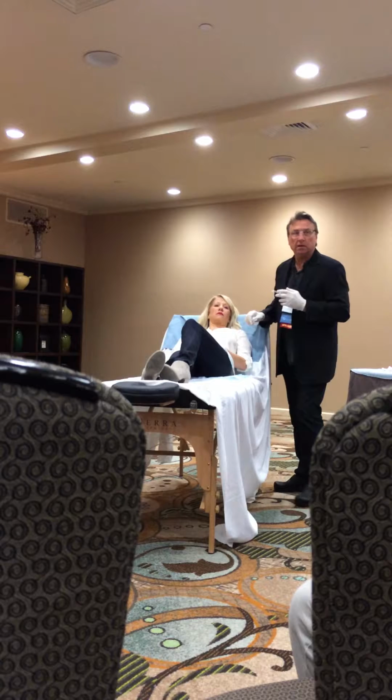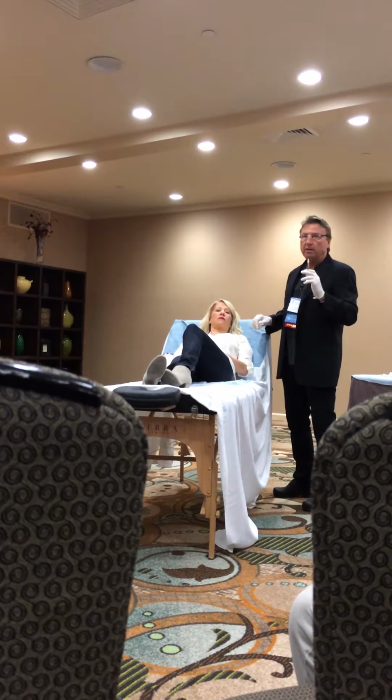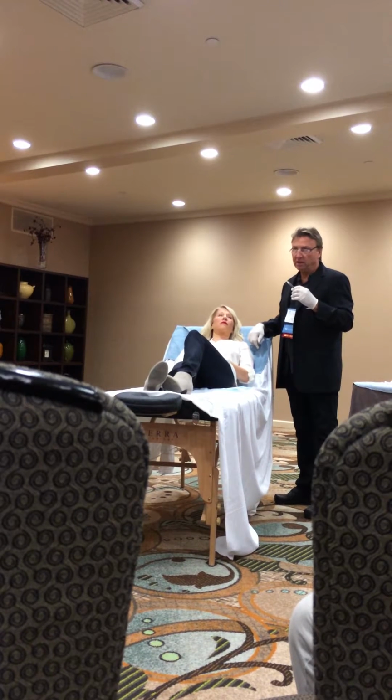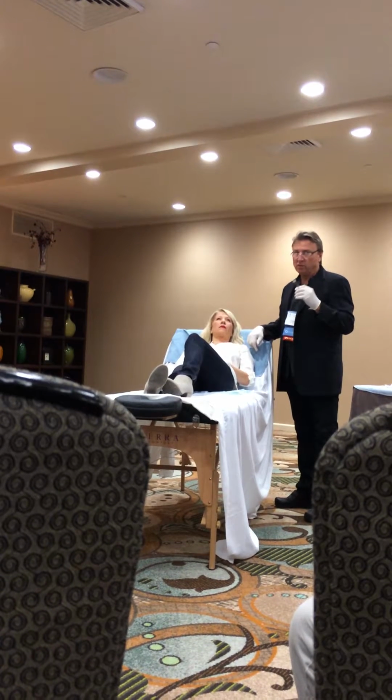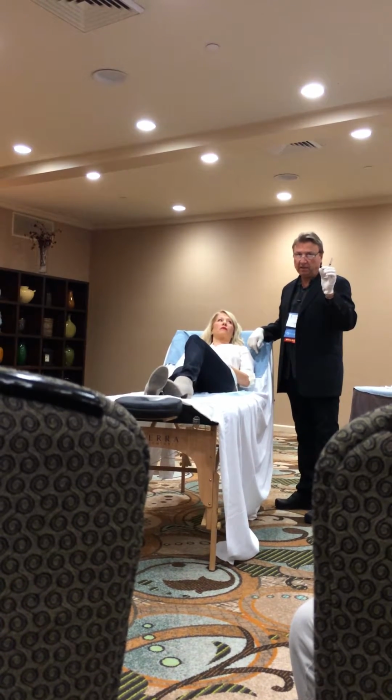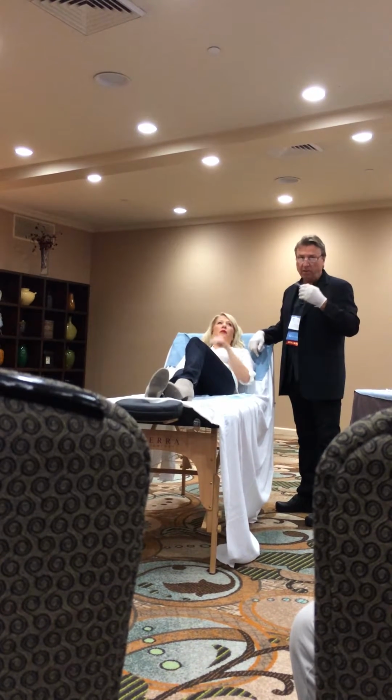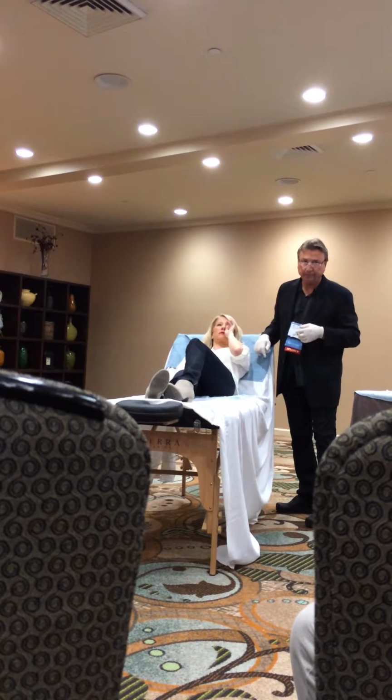I use a 30 gauge needle, and Peter's going to talk to you about his needle, which I think is really cool, and I'm going to start using it. It's a 27 gauge, 1 inch, and it's blunt at the end, and it's got a little port on the side, with the concept being that it might be harder to get into an artery. Yeah, sure.